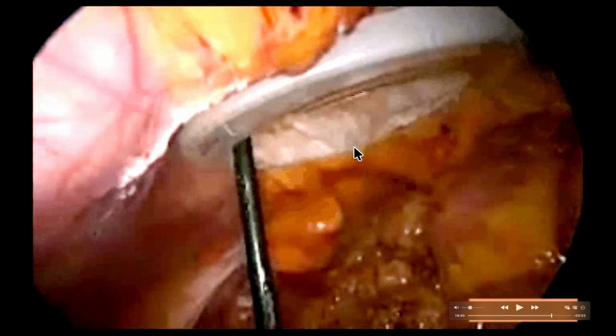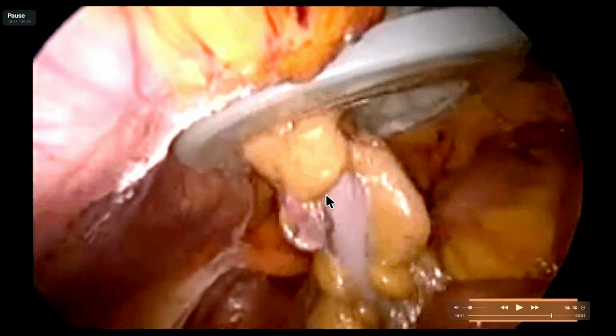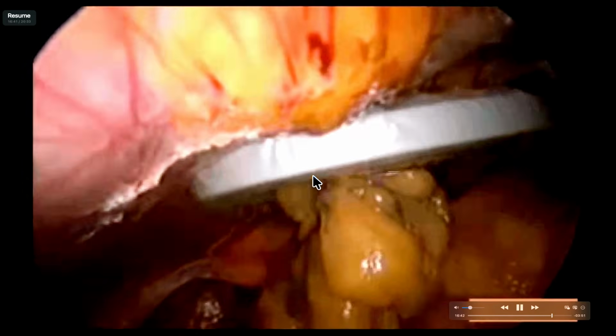You will put a grasper at the sigmoid. This is the inguinal ligament. This is the anterior superior iliac spine. This is the mid-clavicular line. This is the midline linea alba. And here is the pubic tubercle, and this is the suprapubic. And now this is a silicone ring inside the abdomen, and this sigmoid is going out. And it is pulled out, and it's out. And this wound protector is not allowing contamination to reach the abdominal wall.